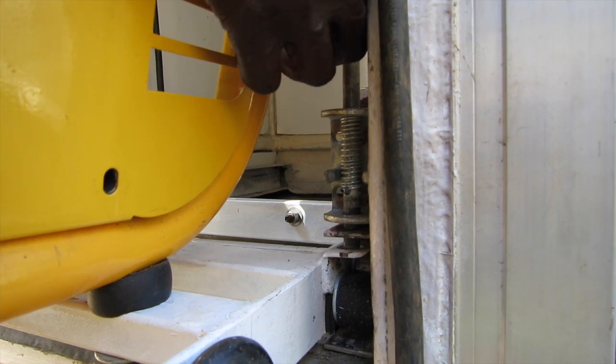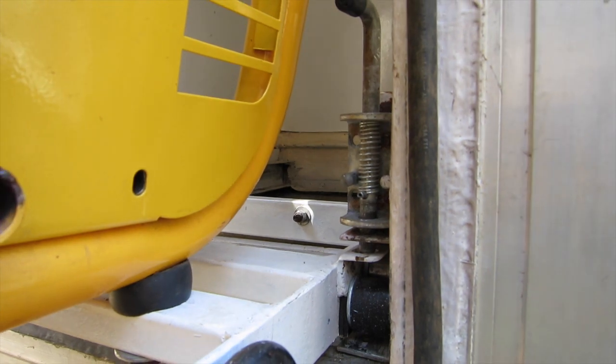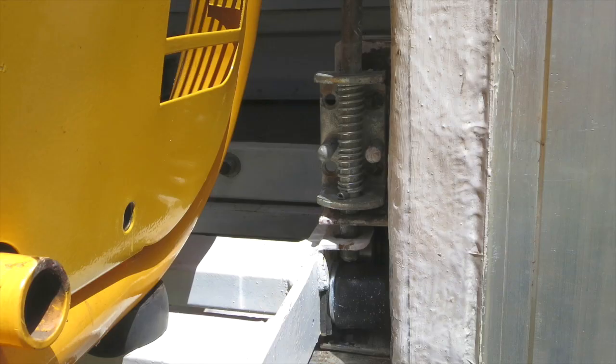In this example, you can see that the latch is stuck and is not engaged completely. Correct positioning of the retaining latch is shown here.